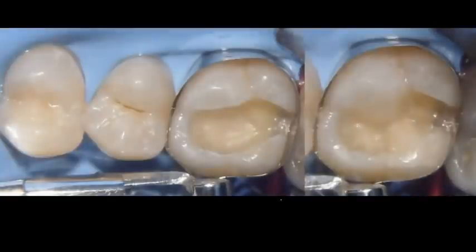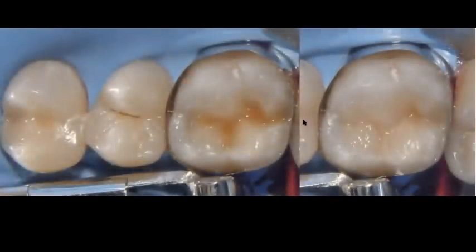We're going to place, in this case, a Tofflemire band. We're going to start building. We haven't built our distal wall here. We're building our cusp. This is not a very deep preparation, so there is no horizontal layer. We're now going to build our distal wall, and then we're going to put every single increment. And you can see one cusp at a time. The distal lingual, the mesial lingual, the mesial buccal, and the distal buccal. And all these cusps come together and form our central fossa and our distal lingual groove.